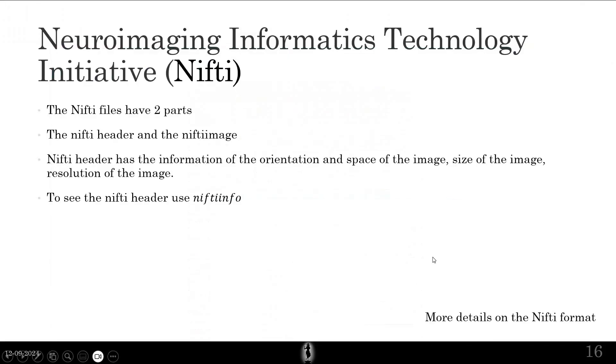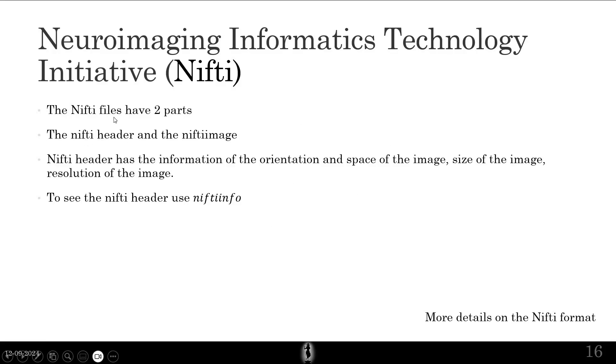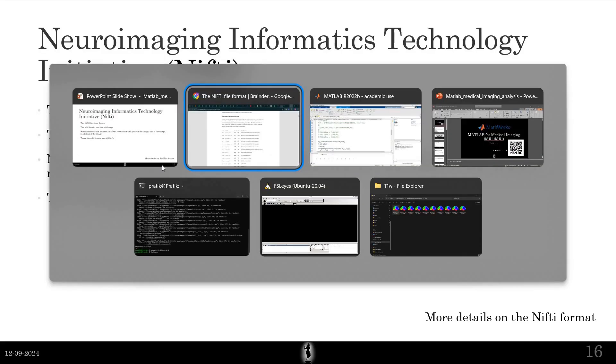But what I will tell you is what basically I think is important. Nifty has two things. It has what is called as a Nifty header and the image. The header has the information of orientation, the space, the size of the image and let me go to MATLAB.